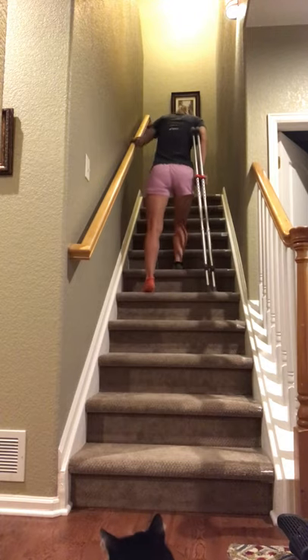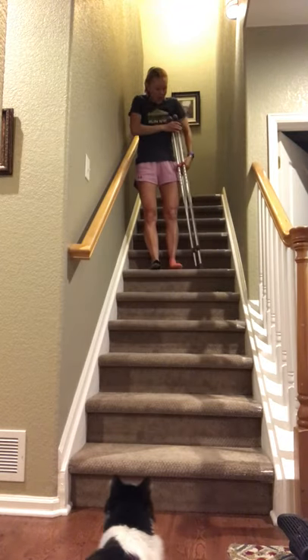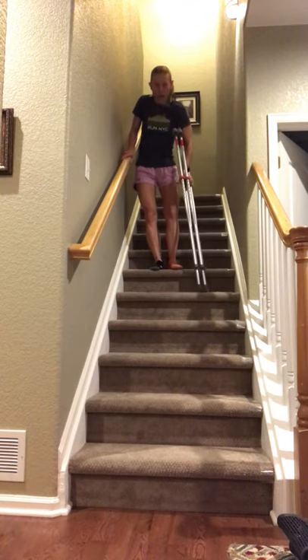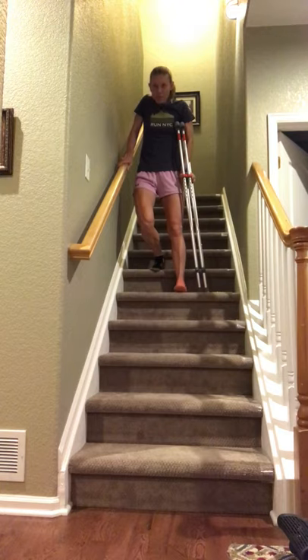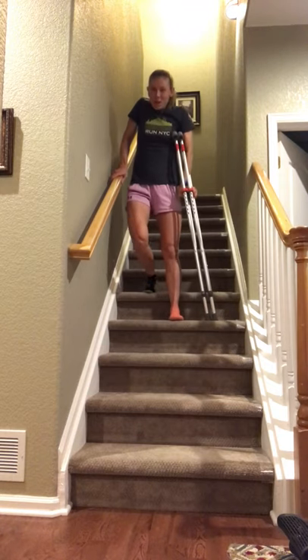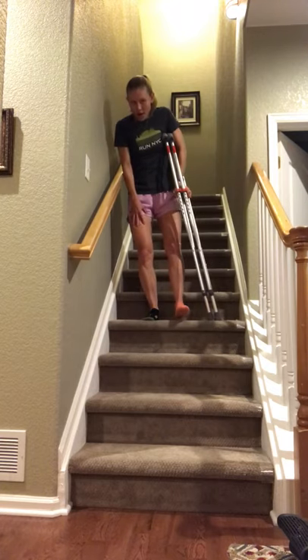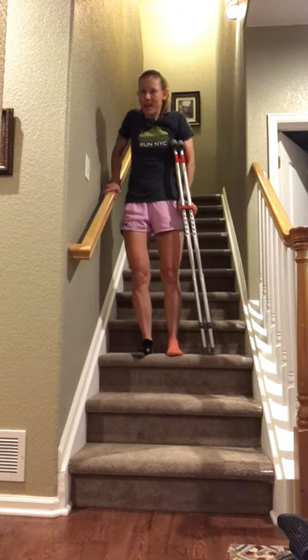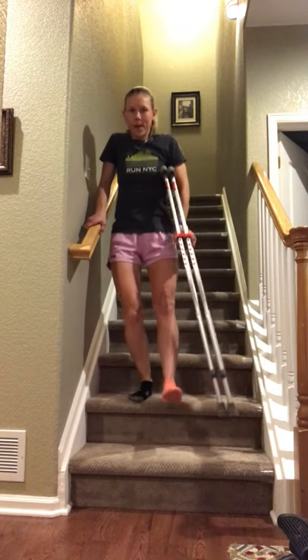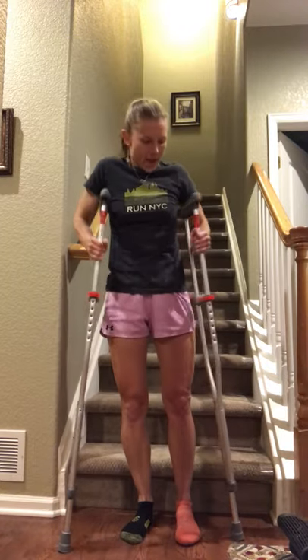Once you reach the top, I would not recommend turning around mid-stair. Coming down is the exact opposite: bring the crutches first, then my bad leg — I'm really not putting much weight on that leg at all — and my good leg controls all the movement down. People get nervous that you're hopping or will land hard, but if you put all the control on your good side, the crutches and bad leg come down nice and easy. Nothing jarring about it. Once at the bottom, get your balance, get two crutches, and take off.